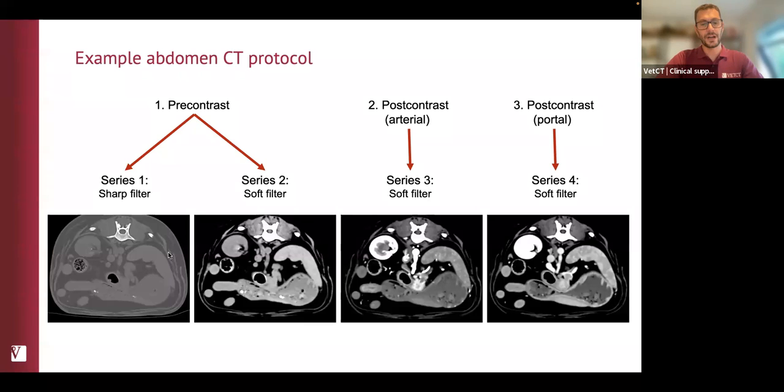Here you want to see that calcification in the kidney. I know in the abdomen, some people don't do the bones, but we've got a spine. We may as well look at it as well as we can. And also things such as tiny, small bubbles. I've got really good examples of small bubbles free inside the abdomen that are not visible in the soft tissue image because they are blurred out. Or small ureteric stones and things like that. So definitely always make sure you do both. And then for the subsequent series, just do the others.